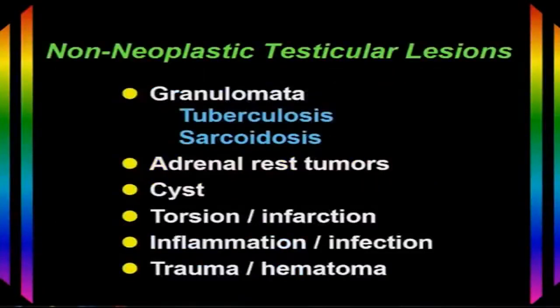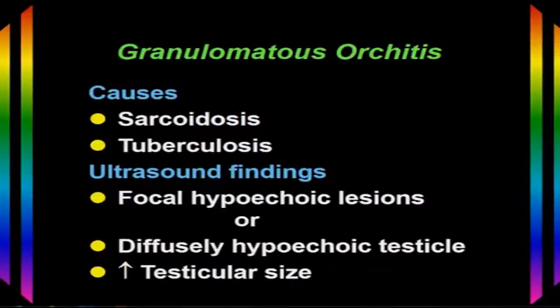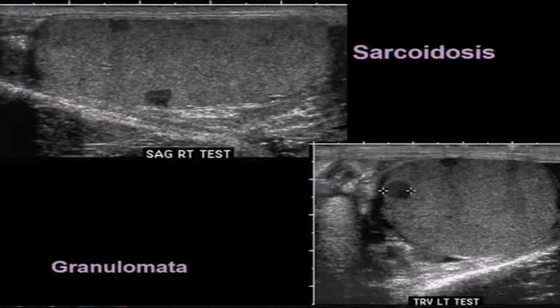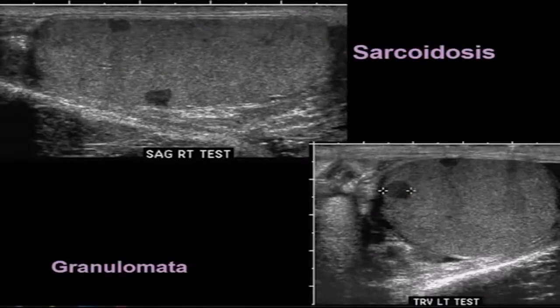Sometimes we encounter other lesions in the testicle that are non-neoplastic, such as granulomas from tuberculosis or sarcoidosis, and rarely adrenal rest tumors. Granulomatous orchitis can be caused by sarcoidosis or tuberculosis and may present with focal hypoechoic lesions or diffusely hypoechoic testicles with enlargement. Here's a patient with sarcoidosis who had multiple hypoechoic lesions in each testicle, all similar in size and echotexture — given his history of sarcoidosis, the diagnosis of granuloma was made.